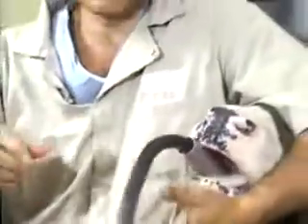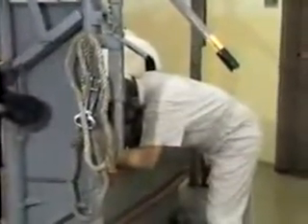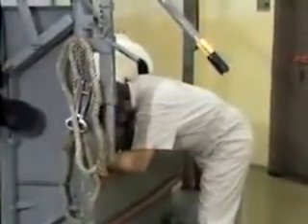At this point, we can test to be sure the tube is in the correct position by blowing on the end of the tube and having an assistant listen for bubbles.